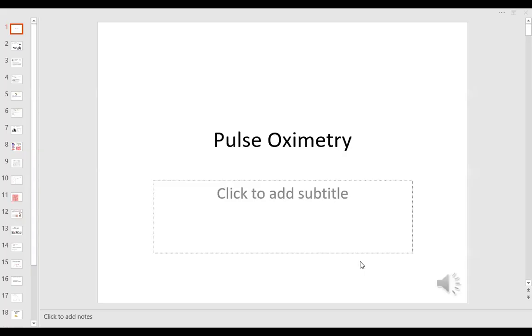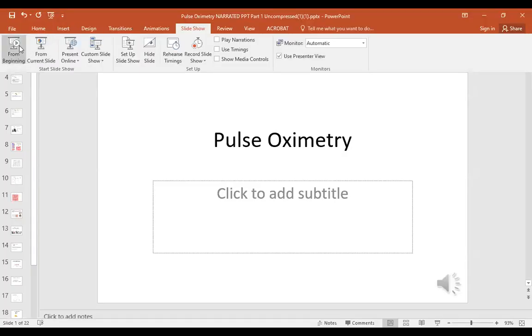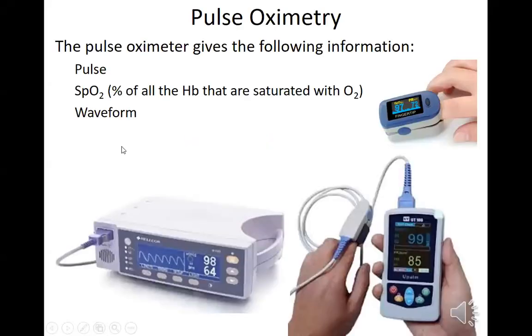We'll start at the beginning. Slideshow, if we can. So pulse oximetry, and this is the pulse oximeter, which we showed you before. If you come into the lab anytime, it's very easy. It just takes a couple of seconds to get it started, and in a minute or two to get it working. You'll see the oscillatory pulsations, and you'll get the hemoglobin saturation of oxygen in percent.